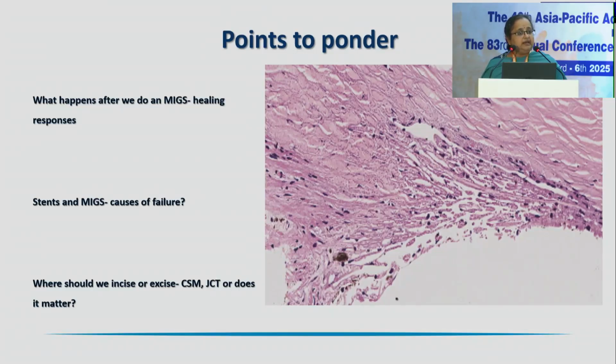These healing responses that occur after an incisional or excisional procedure are equally important to be imaged on ASOCT or UBM and correlated with your clinical findings. We don't know exactly where this healing response comes from. You see hypertrophic scars. You see sometimes the ridge closed by fibrotic tissue, but where is that fibrotic tissue coming from?